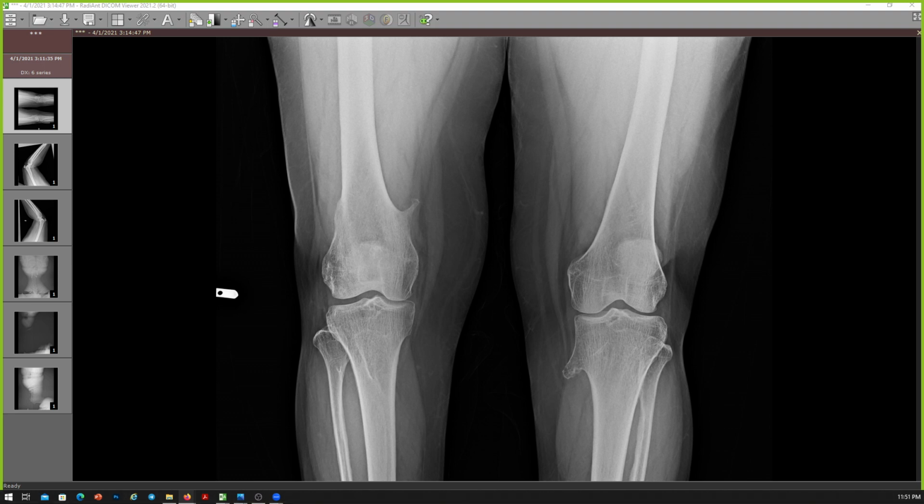So just remember that. Suppose if they show you such a case along with a hand radiograph with multiple enchondromas, so you should know this. Other than that, well done. I am pleased with you. You are clear, you're confident. You always ask for previous images. That is good. You have good knowledge, and your speed is perfect.